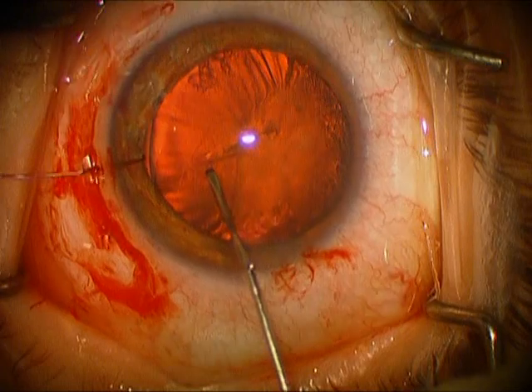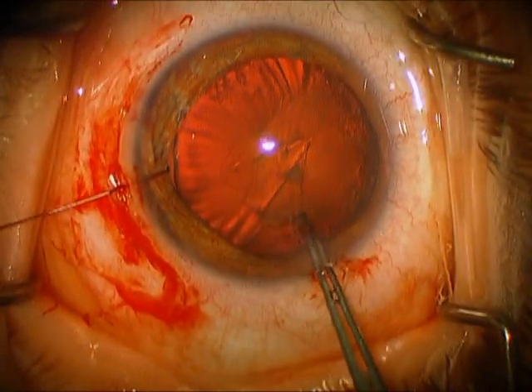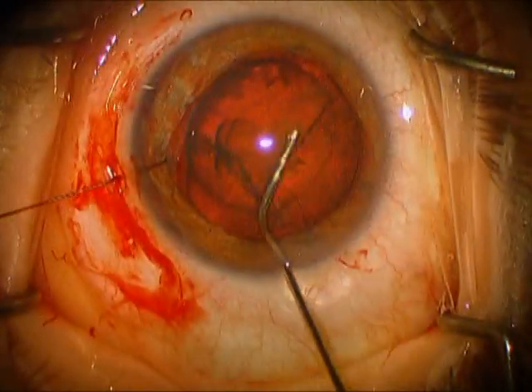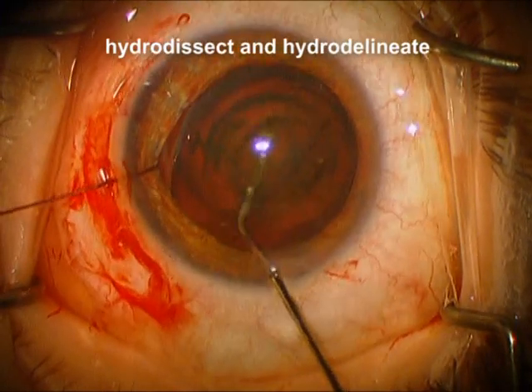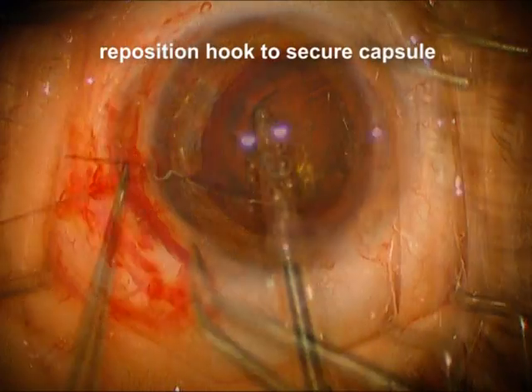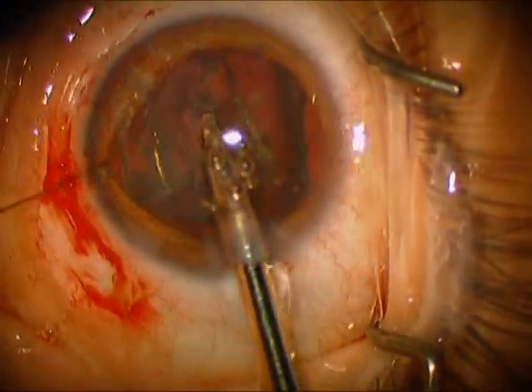We're going to take the cystotome and tear away from the good zonules, get this started, and then bring it around with Utrata forceps. We're hydrodissecting and hydrodelineating, and this soft nucleus has come forward. Now we're going to catch the anterior capsule with the iris hook so we get some additional support in the area of the weak zonules.